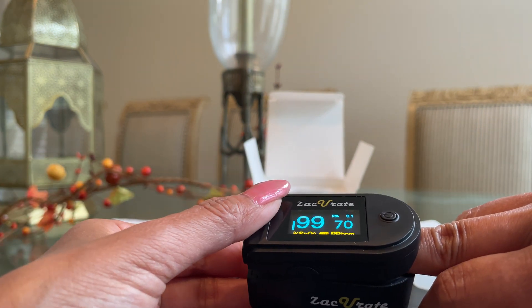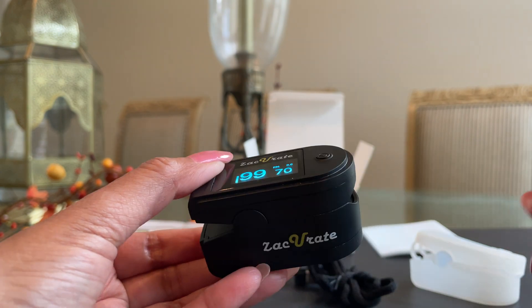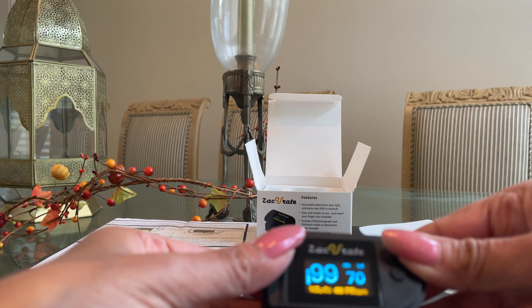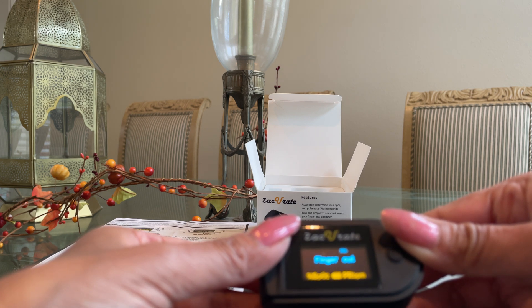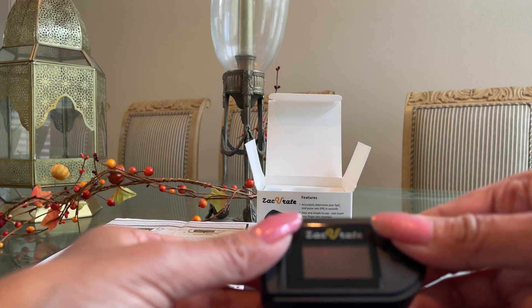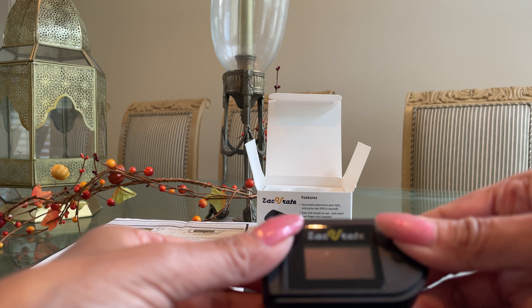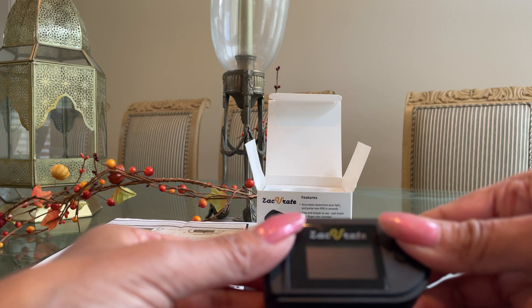Once you're done checking your results, remove the finger. After it says 'finger out,' in about six to eight seconds it goes into an auto-off mode. This smart feature saves battery.